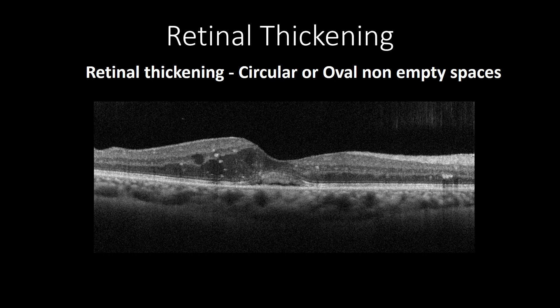This cross-section shows central diabetic macular edema with increased macular thickening, non-empty cystic spaces, and subretinal fluid with hyperreflective foci, which may be due to activated microglia and inflammatory processes. In cases where the hyperreflective foci arrange in a circular fashion around the cystic spaces, it might indicate an exudative vascular chronic process. These do not usually cast a shadow.